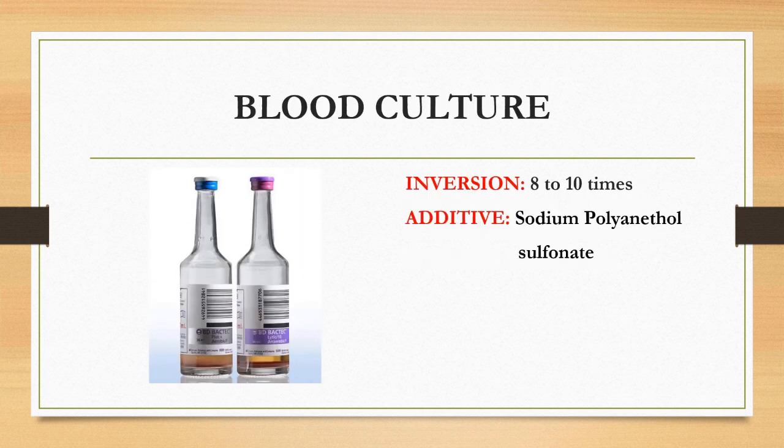For instance, if a patient is admitted in a hospital and the doctor advises you to send some blood samples, which include blood culture, CBC, biochemistry, coagulation profile, and so on, in this case you have to take the samples in order to prevent any value changes in the blood reports. So let's see about that.